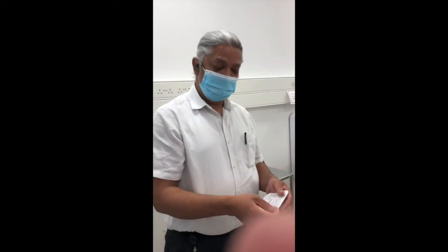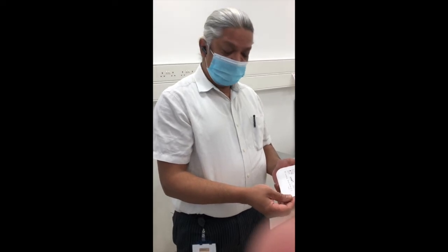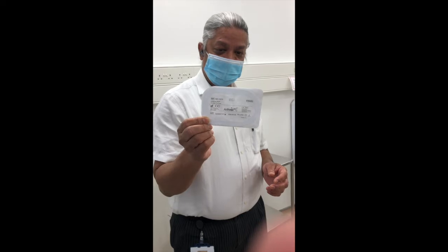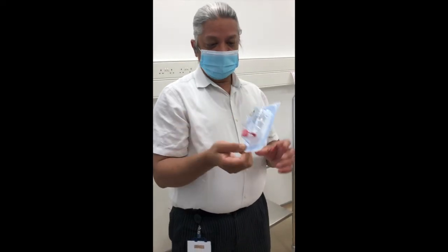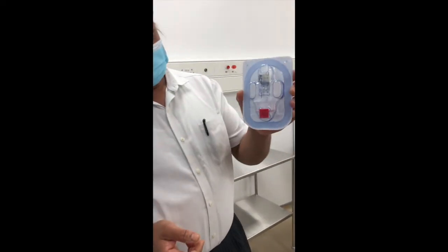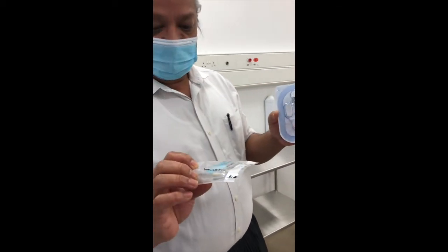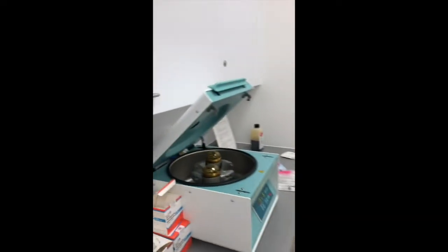We are preparing a PRP injection for distal biceps tendinopathy, using one of the numerous kits available on the market. This involves taking 15 ml of blood and then spinning it in this machine for five minutes.